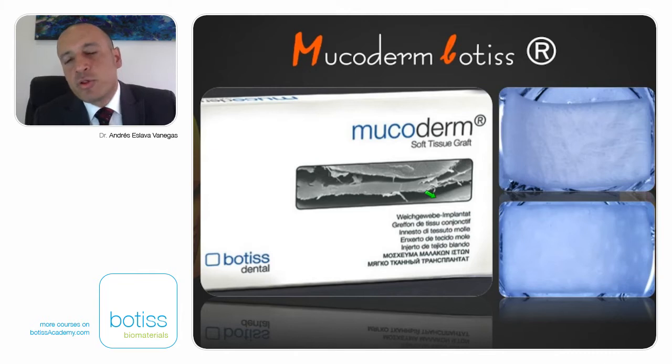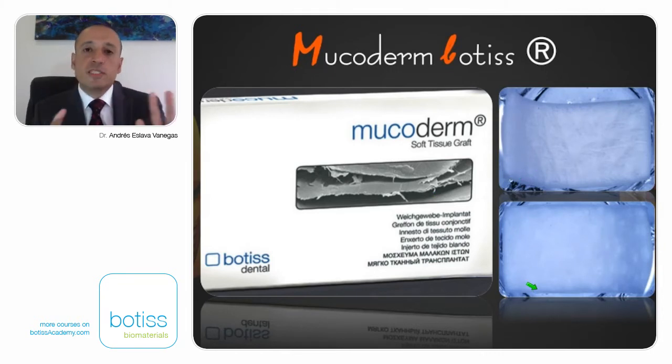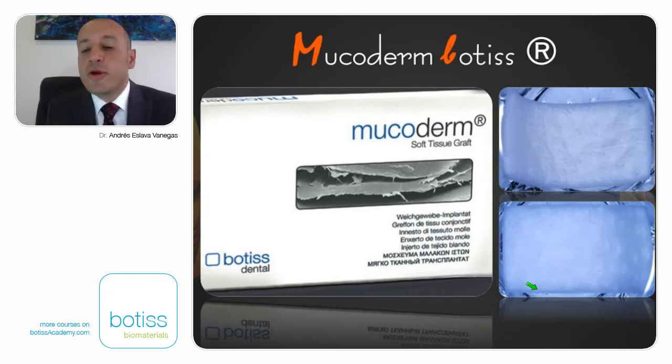Now we have Mucoderm. Mucoderm is a porcine acellular dermal matrix. It has collagen and elastin, and it also has a dermal side and a reticular side. But there is a difference from the other dermal grafts. There is just one thickness of this graft, about 1.6 to 1.8 millimeters. There is something else, and we're going to talk about it more later, that it is more stable than the other one. Puros Dermis is stable between 2 to 3 months. This is stable between 4 to 6 months.